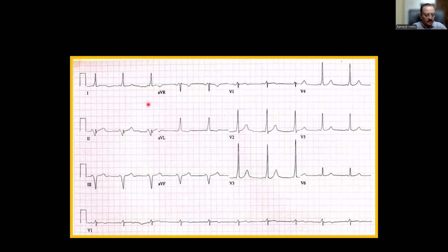See this ECG. Look at here. See this PR interval. Do you think it's normal or abnormal? Let's choose lead 1 here. Lead 2 is not very clear. Abnormal, sir. It's a very short PR. No gap.